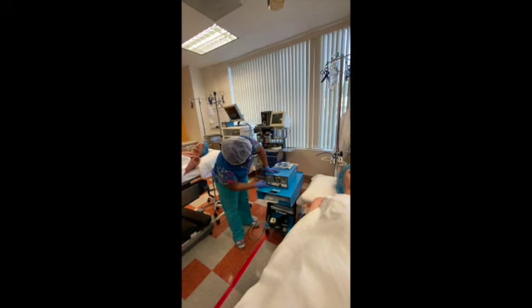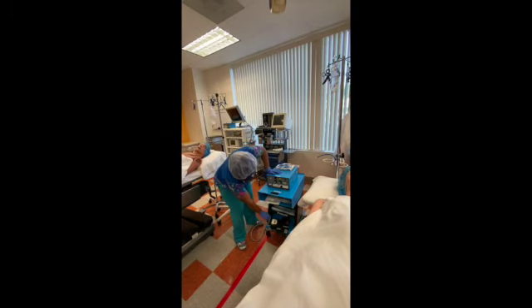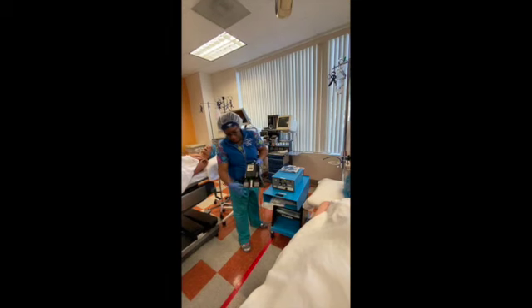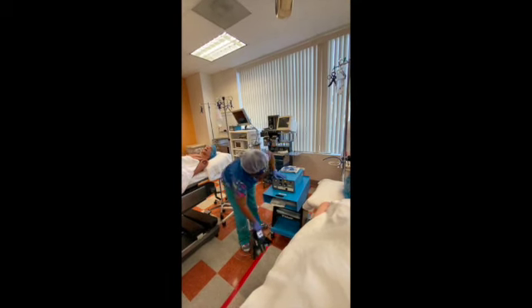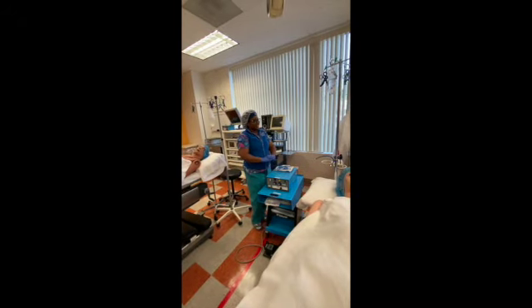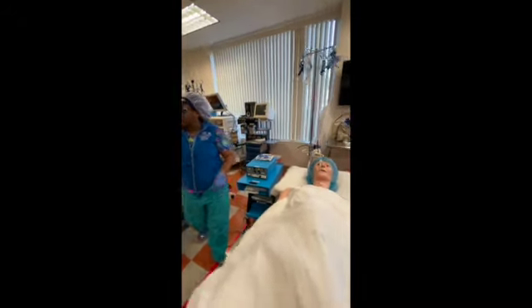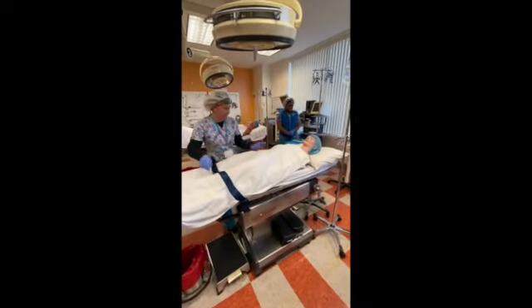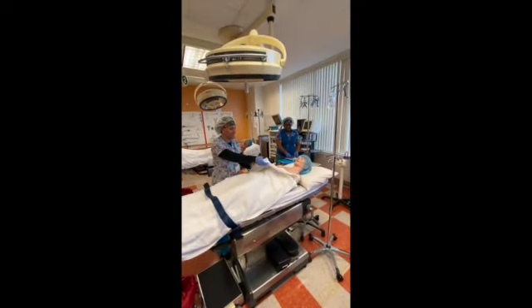If we're using the foot switch, you have your foot switch here. It also shows you cut and coagulate. So you're checking all the functionality. Next, assess the patient's skin before application of the grounding pad — ensure the skin is dry and free of hair.